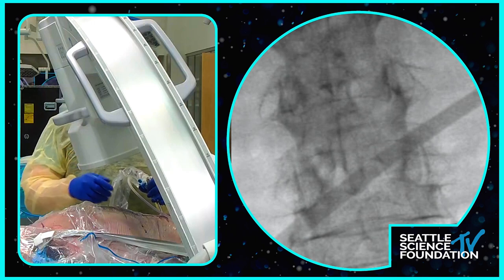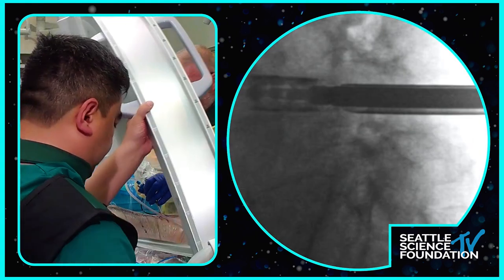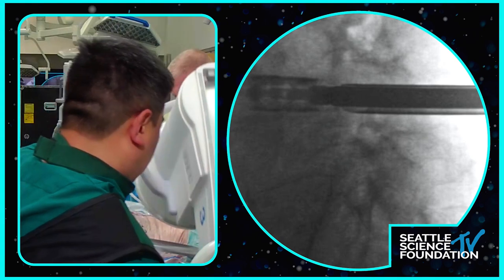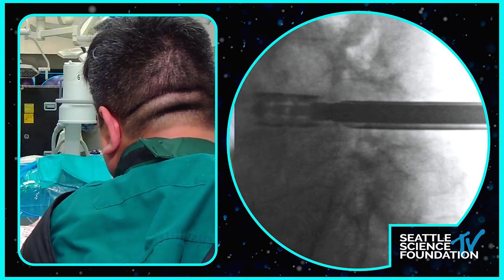So you see parallel to the disc, come lateral. Ben, can you change the image a little bit? You see how we medialize the starting point? We're a little bit oblique on the x-ray, but kind of dealing with what we got. Ben, can you get to the last AP we just took, Ben? Not that one.